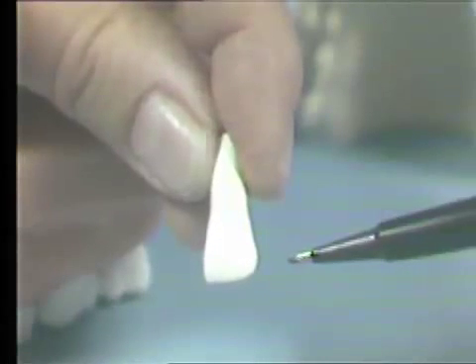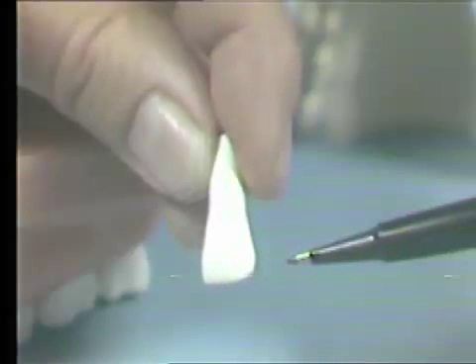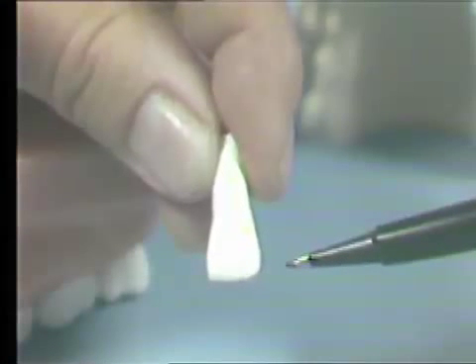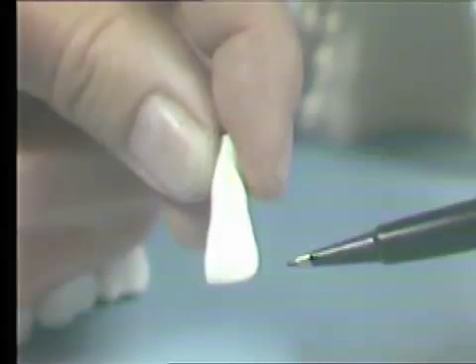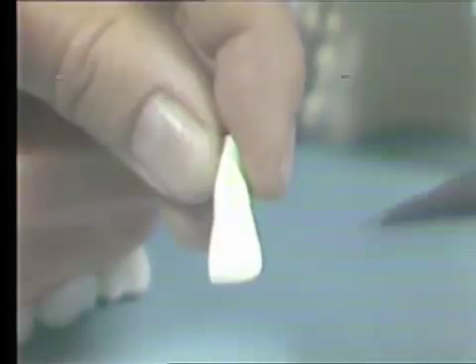Let's review the basic anatomy of the lateral incisor using this large model. Note that as the tooth emerges from the soft tissue, there is a concavity on the mesial and distal that allows room approximally for the soft tissue. We will duplicate this contour in the pontic.